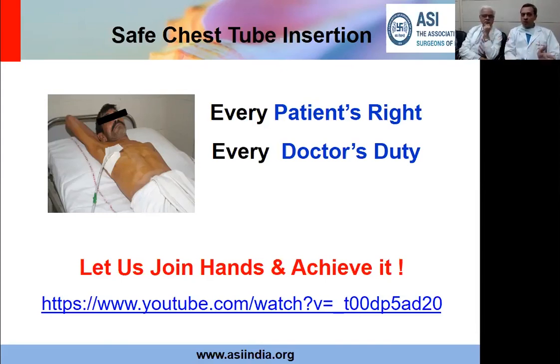So suppose there is a malignant pleural effusion, I put a chest tube, fluid drains out, lung expands. Now this is the time I can put talc slurry, talc mixed in saline, that can be put through the chest tube. It gets distributed across the chest, it will cause irritation. How does it work? It causes irritation and inflammation of the pleura. Inflamed pleura get adhered to each other. Whether you use talc, rubbing, betadine, or a blood patch, whichever agent you use, the prerequisite is a fully expanded lung.